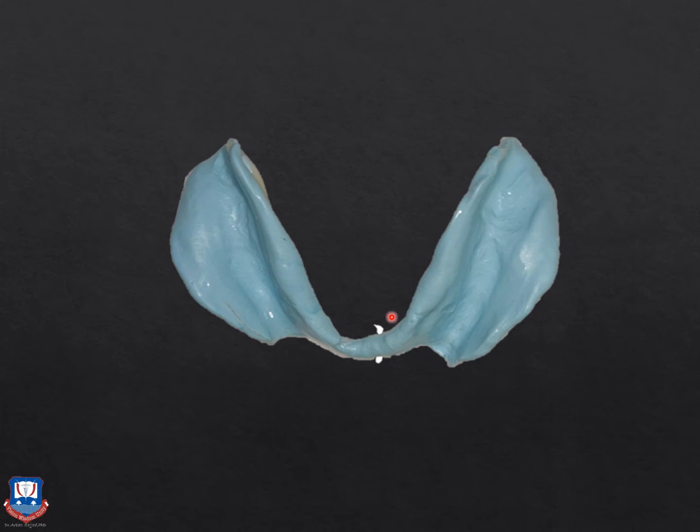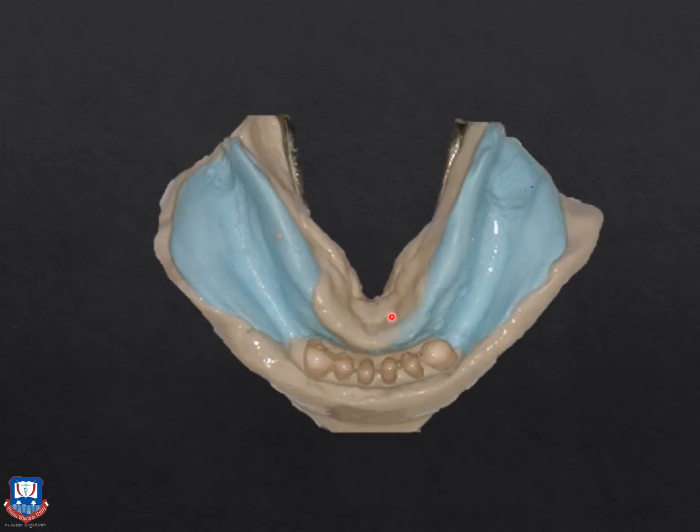Once this impression is done, it is ready. Without removing this impression, using a stock impression tray and alginate or agar hydrocolloid, a pickup impression is made. So the distal extension bases have been recorded under occlusal loading, and the rest of the impression, that is the abutment teeth and the pickup of the functional impression, is done in a passive or anatomic state.